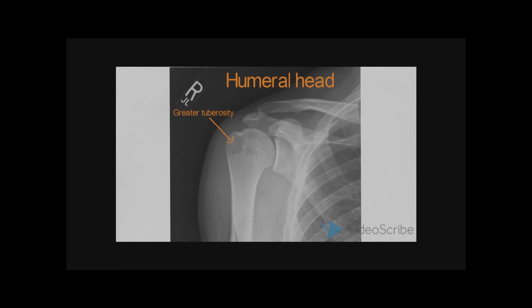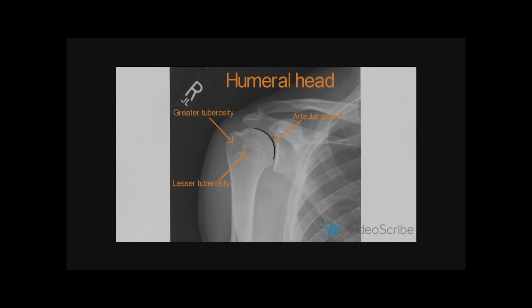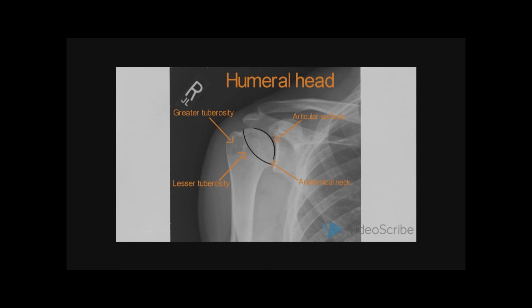Having assessed the articular surface of the humeral head, we need to further look at the glenohumeral joint space. This is the joint space identified between the glenoid cavity and the humeral articular surface. It is important to distinguish between fractures of the anatomical and surgical neck, as blood supply to the main head fragment may be disrupted after fractures to the anatomical neck, and avascular necrosis in such scenarios is more likely to occur.